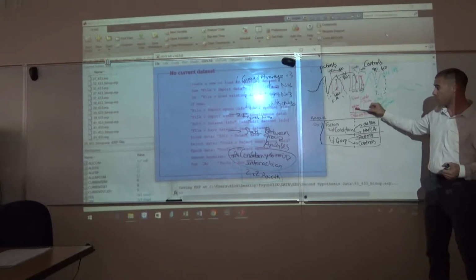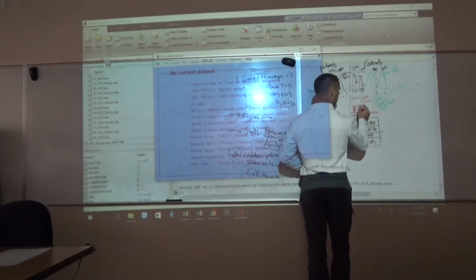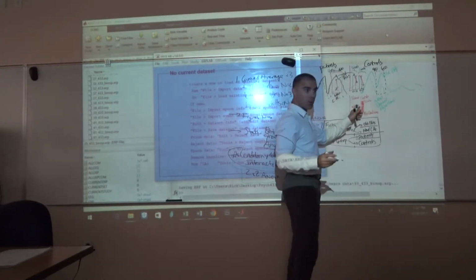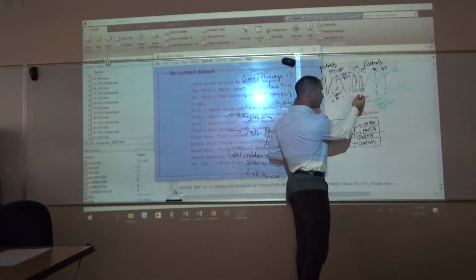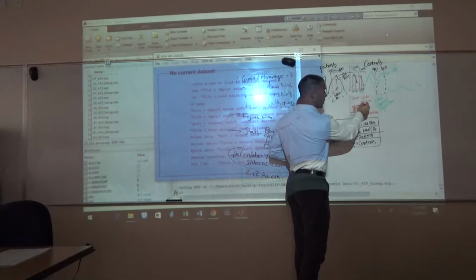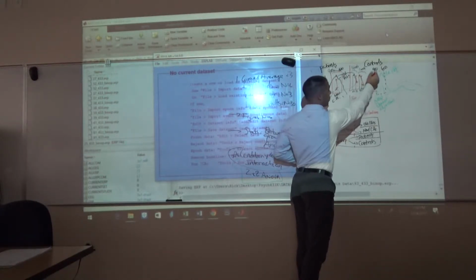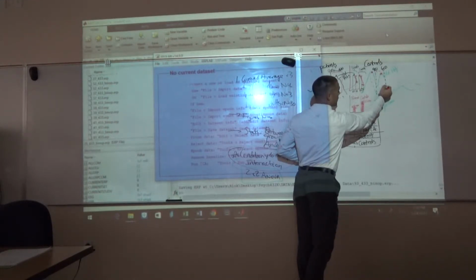See how this is shorter, this red bar here? Shorter than that red bar? Okay. So this represents the subtraction of old minus new. Just like this represents the subtraction of old minus new. The difference between this amplitude and this amplitude, which represents this, or I'm sorry, it actually represents this versus that.